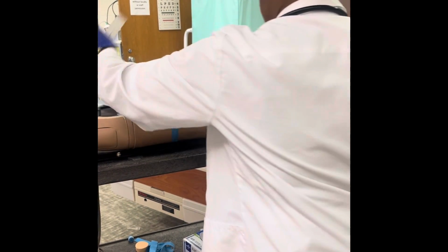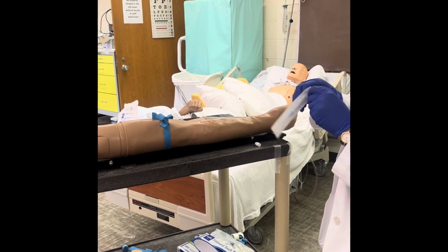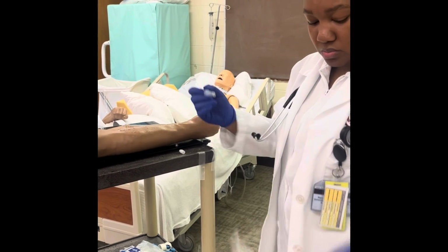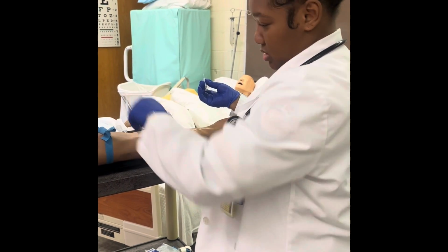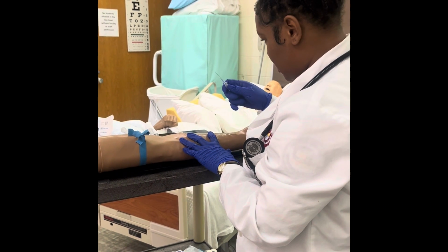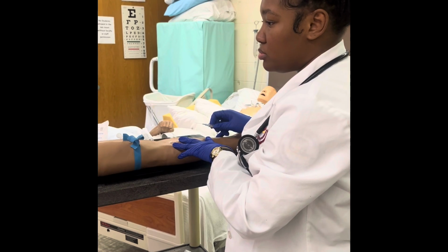I'm gonna get my needle out. All right, Mr. Smith, I'm now going to insert the needle. You might feel a little poke. So as I insert, I'm going to go bevel up, and I'm going to pull the skin tight to make it easier for the needle to go in.